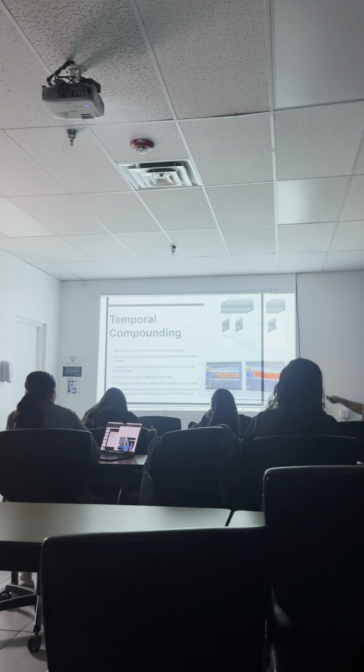Okay, so as we can see here, this one has no persistence, and the vessel looks like it's not completely filled with blood, right? Is that good or bad? Bad. This is bad because this tells me that there's something here that's not letting the blood flow. It could be plaque or something like that.